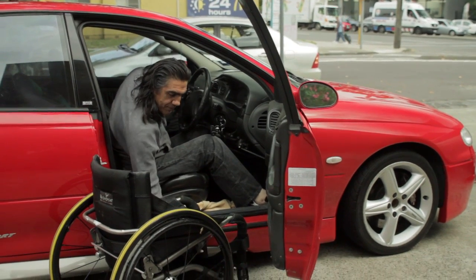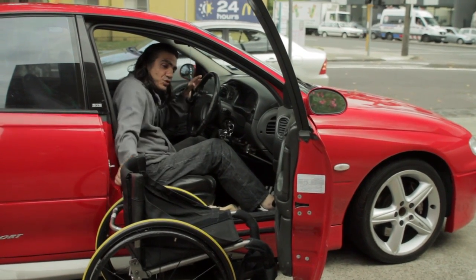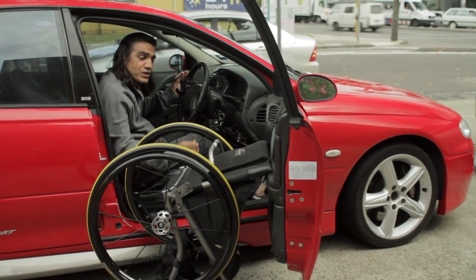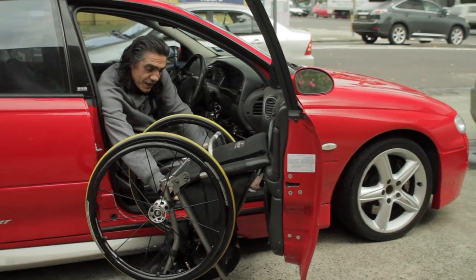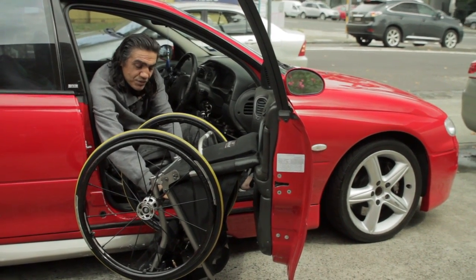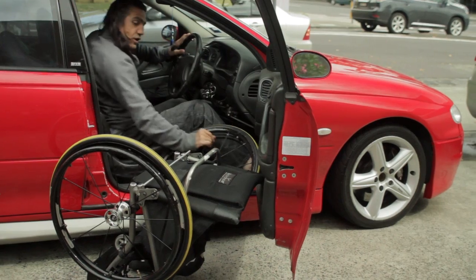And because, like I said, I'm a C6 quad, paraplegics would do it differently to the way I do it. I just stand the wheelchair like this so the wheels are free, and after that I put one arm in between the wheel itself and the frame of the wheelchair, so I've got some pressure against the wheel, and with the other arm I'll just push the button. That'll release the wheel, and then the wheel just falls off.